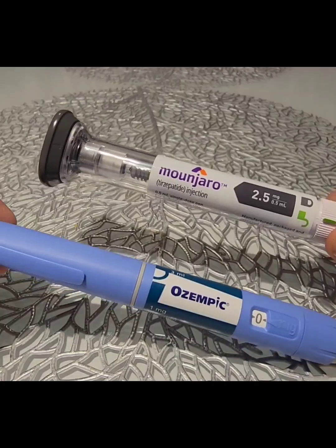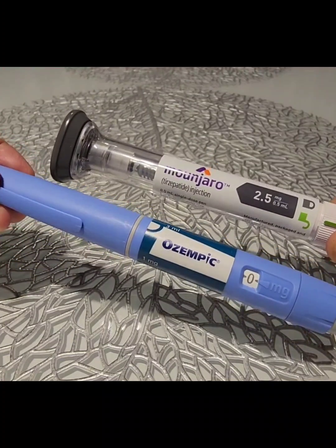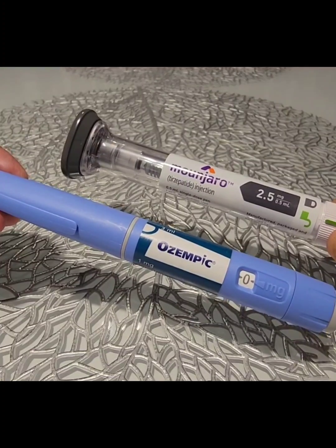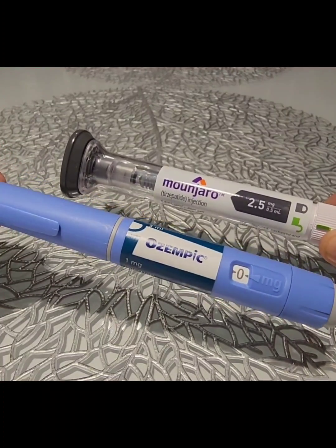They come in injectable pen devices as you can see, but there is a difference between the two devices and it does create some confusion for some of our patients.